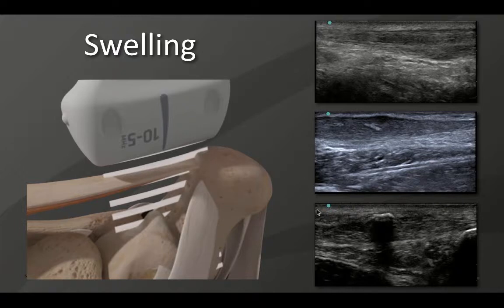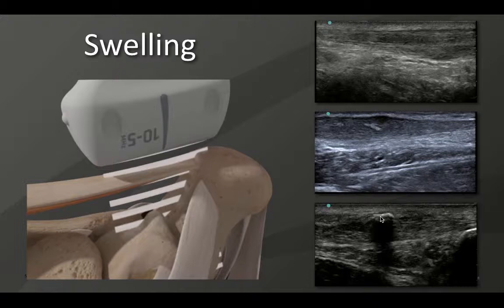A more mature calcium deposit showing shadowing is seen here — what's called a posterior acoustic shadow — on the superficial surface of the Achilles tendon. This almost looks like a tophus. These things are very common when we look at old injuries in athletes or former athletes who've had Achilles tendon strains; we see these calcium deposits pop up all over the tendon. We equate those with old scars that have eventually solidified and calcified. As they become more mature, they'll actually cast a shadow, much like cortical bone.